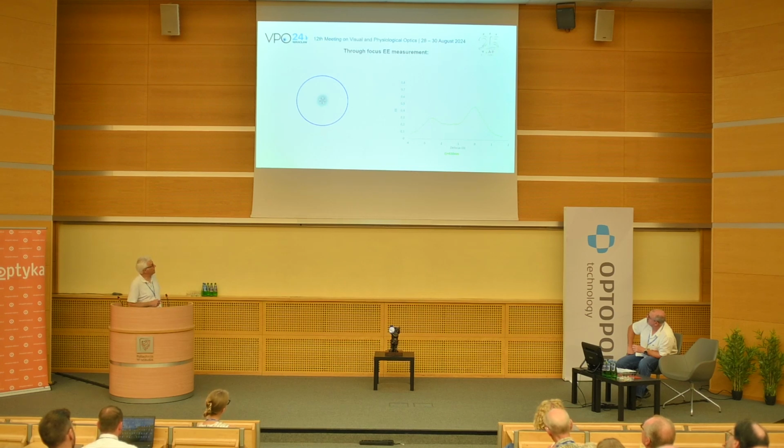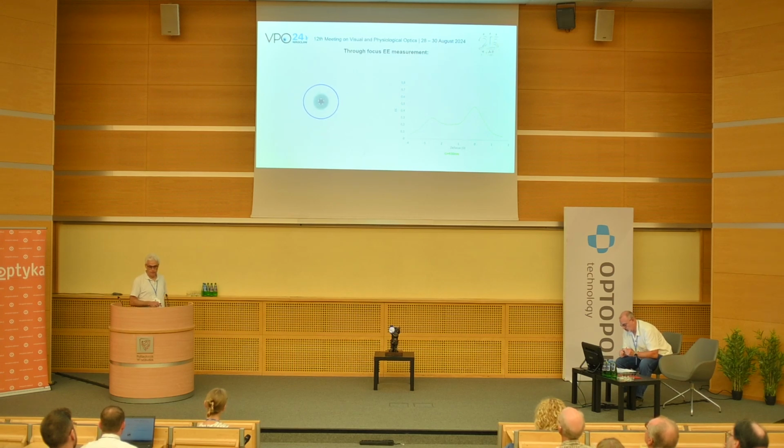For example, in the case before, we have this kind of through-focus video of what is happening all through focus, where we can, okay, we can stop it. Well, we can see that there are two different points that account for the first and the second peak.